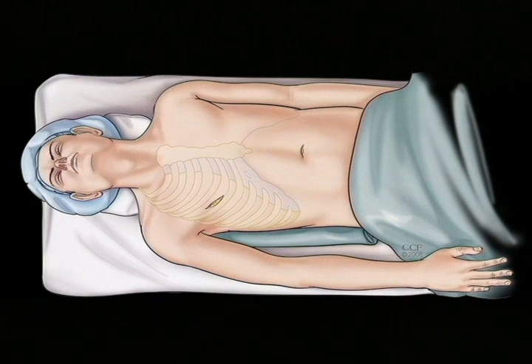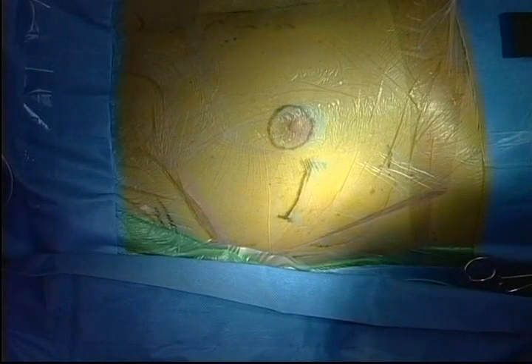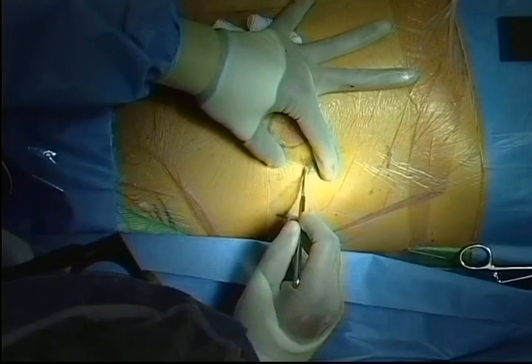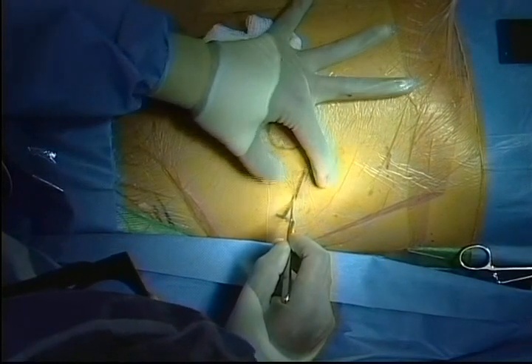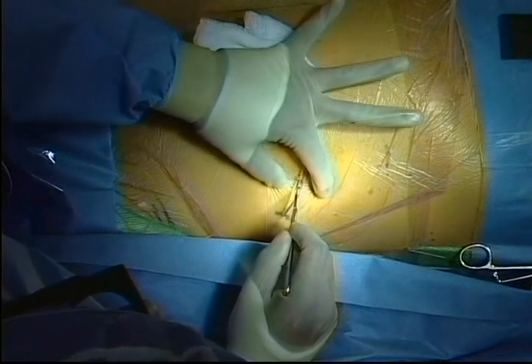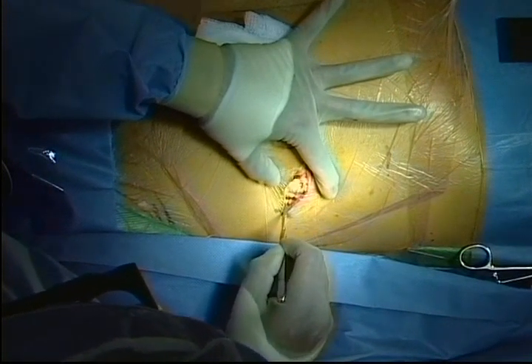The chest will be entered via the fourth right intercostal space. The incision is placed in the inframammary crease lateral to the nipple. Through this incision, with the lung deflated, the chest is entered in the fourth intercostal space, which generally corresponds to the level of the nipple.